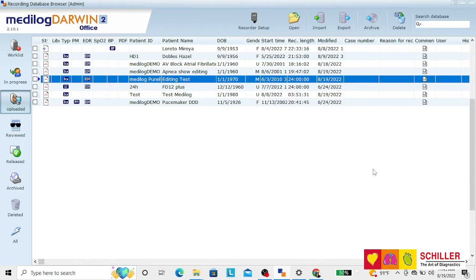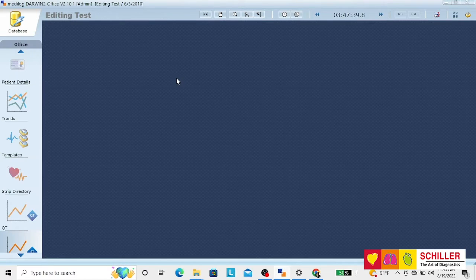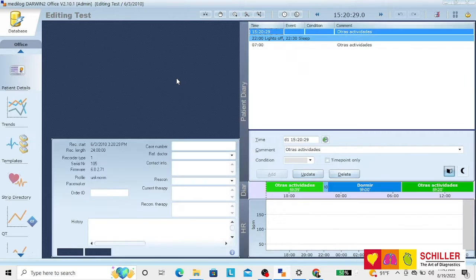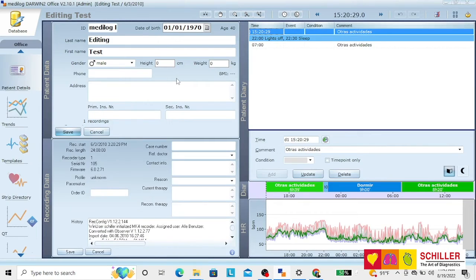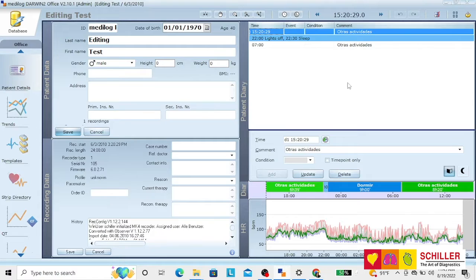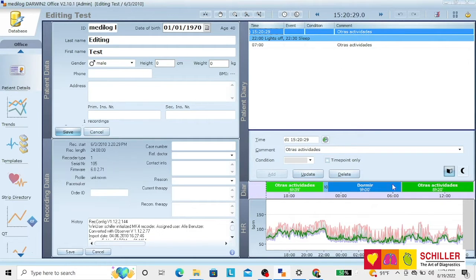Medilog Darwin workflow. Double click on the patient for it to open directly on your Darwin screen. You will have patient data, recording data, the patient diary, and the different approaches.